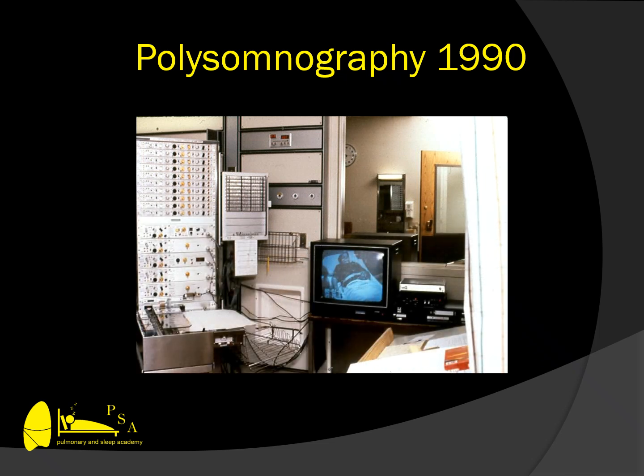So what does a sleep study room and what does the equipment look like? Well, in my first sleep lab in 1990, this is what the monitoring equipment looked like. You'll see on the left is an EEG GRASS machine that's measuring high frequency and low frequency activities, each having their own spot in the setup there. And then the study is recorded with paper, you can see in the bottom left, printing out as it's being run, so that by the morning there is a stack of paper about the size of 2 or 3 phone books.